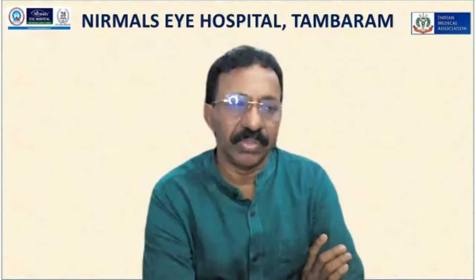And Raju, second thing, it's not only the flash cycle. It also damages the phaco handpieces if you're going to use that for your phaco handpieces. So sir, it's not good.